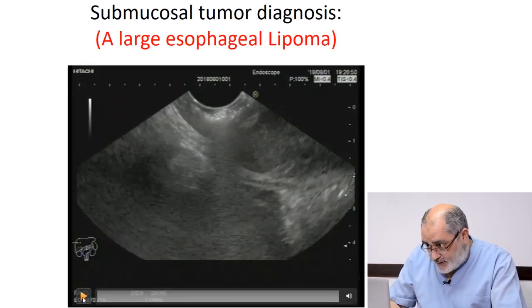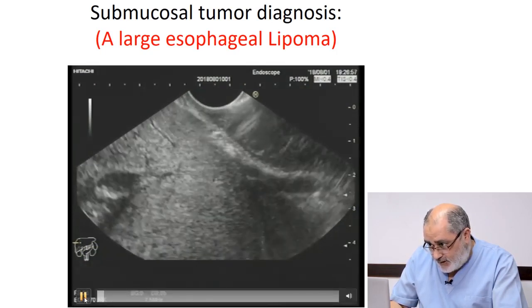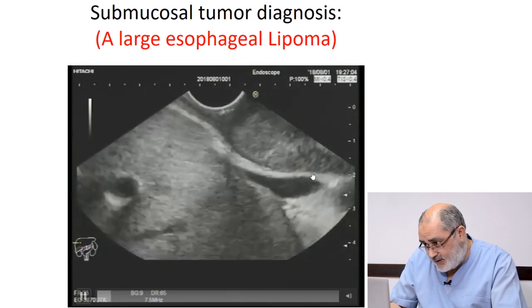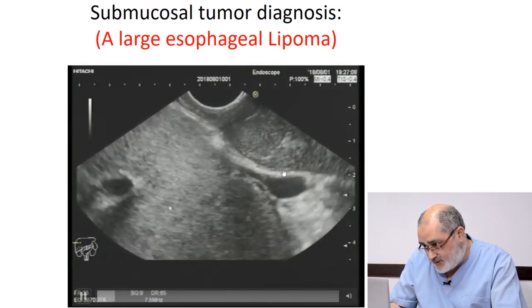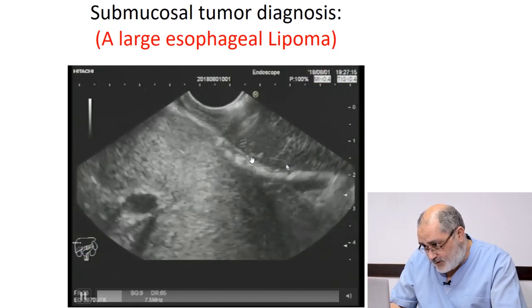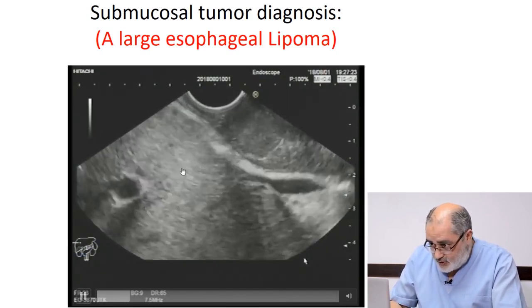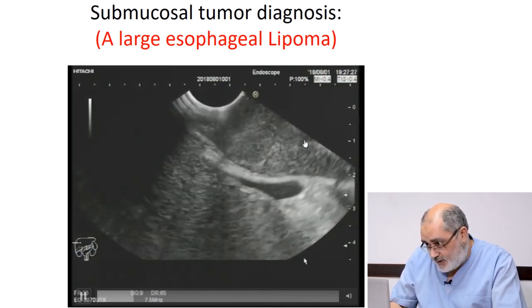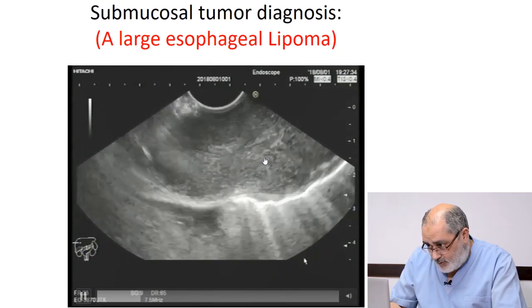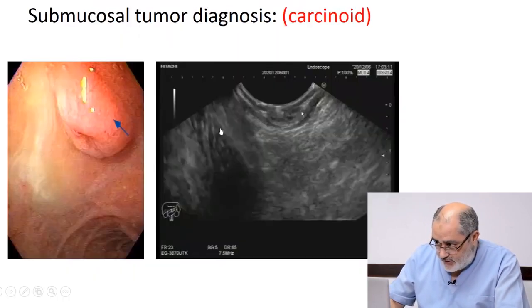This is a case of a submucosal tumor in the esophagus. It is clearly hyperechoic. Here I can see the muscularis propria layer passing very nicely behind this large mass — so this mass is not originating from the muscularis propria layer. It is originating from the layer inner to it, which is the submucosa, and it is hyperechoic, having the same texture as fatty liver. So it is a hyperechoic lesion in the submucosa — almost certainly a lipoma. This is an example of a large esophageal lipoma.